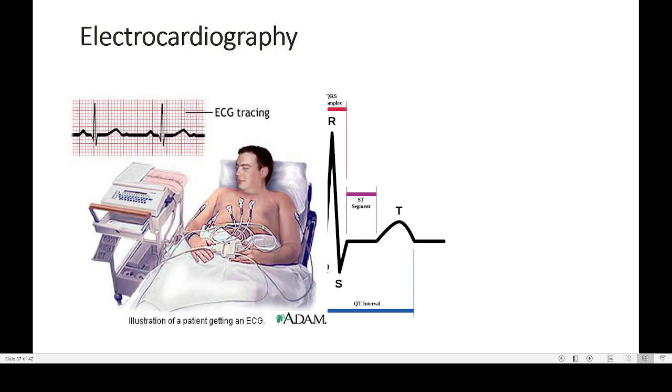Then this is another kind of disease known as Brugada syndrome. Then this is another, this is some changes in kalemia, I think potassium changes. Then the pericardium, the outer covering of the heart muscle, is known as the pericardium. If it has some problem, this kind of smaller ECG is there. Then this is another kind. This is also another kind. So for every pattern of heart muscle problem, we have a different pattern of ECG.